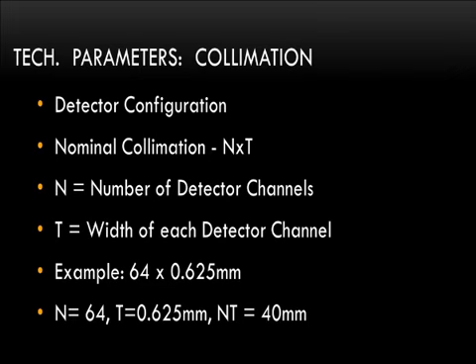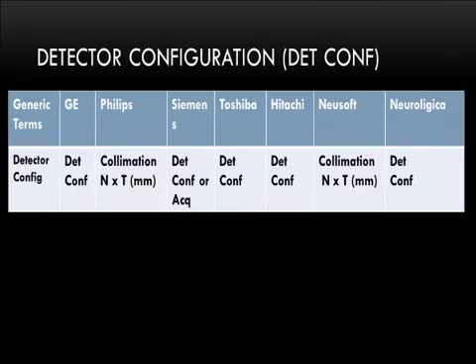The actual beam width would be wider. But we usually don't have that information on the user interface, so we're going to refer to it as the nominal collimation. All right, what effect does that have? Sorry, we'll get back to the effects in a second.